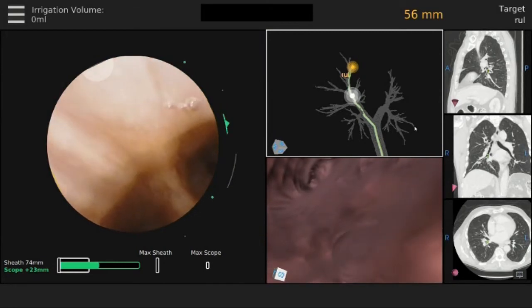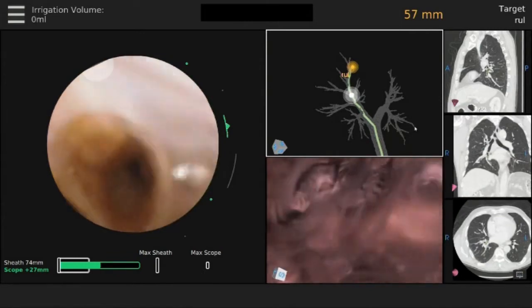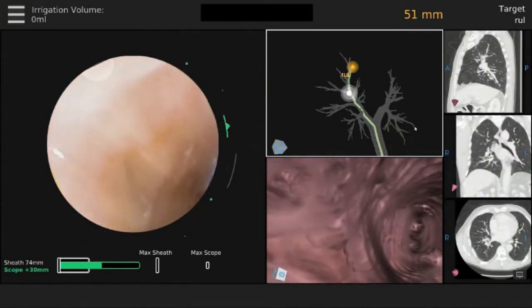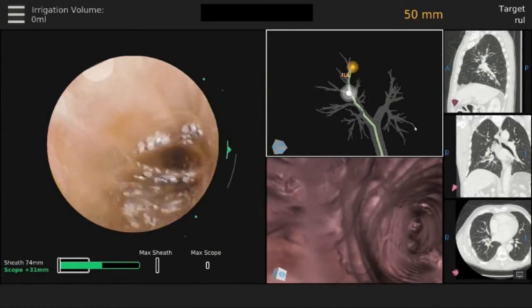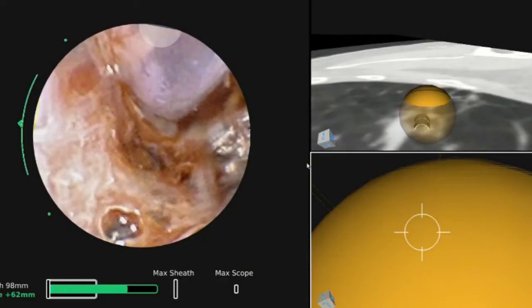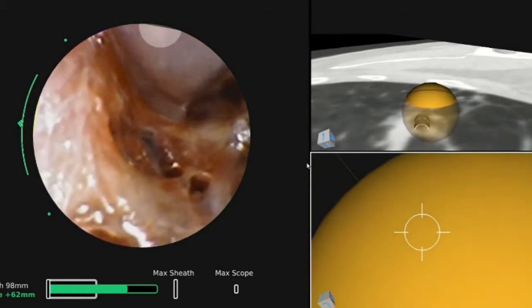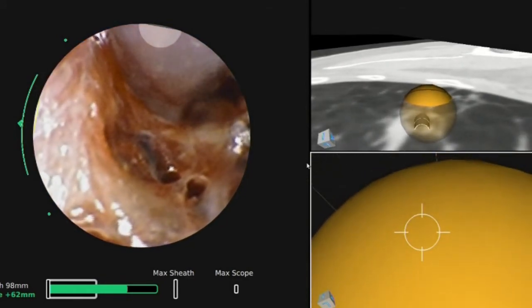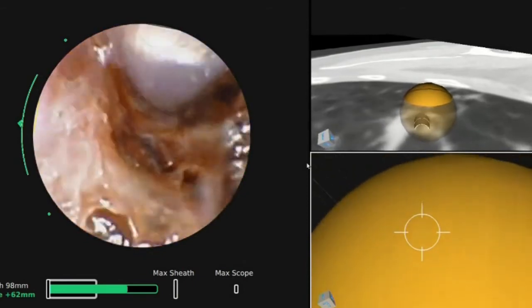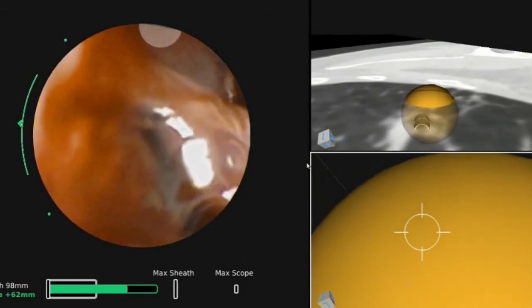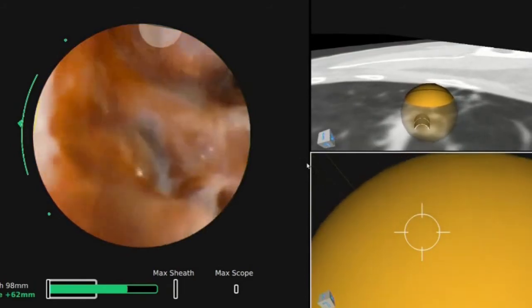There is the ability to provide suction as well as irrigation through the bronchoscope during the procedure. Distance measurements are provided as the bronchoscope is advanced towards the target lesion. The video shows the bronchoscope at the target lesion in the periphery of the lung, with virtual images providing confirmation of accessing the target lesion.